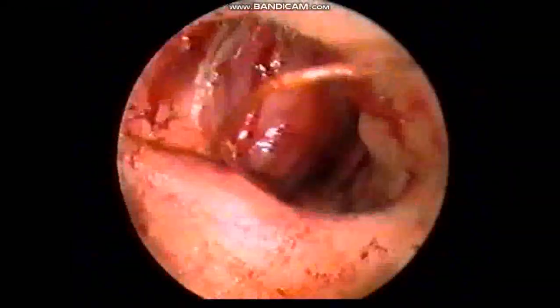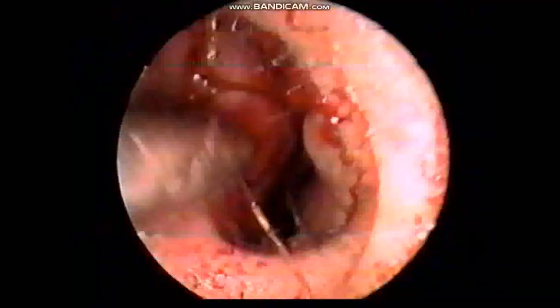Once you put a suture, there you can see the needle coming out. That's the knot.